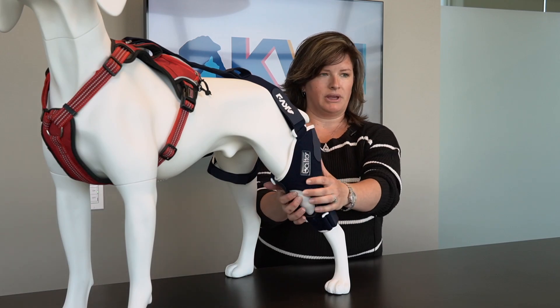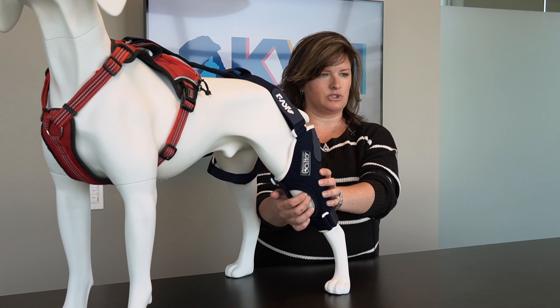With the Balto Jump, we are primarily focused on CCL injuries — the cranial cruciate ligament — and with medial patellar luxations, which we tend to see more often in smaller patients. This particular brace, we're going to palpate the patella or the knee cap as we're trying to center this opening here to position it.